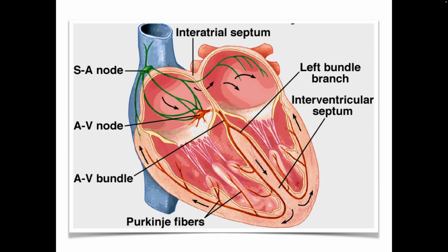What that's going to do is stretch out the PR interval. There it is, there's the block.